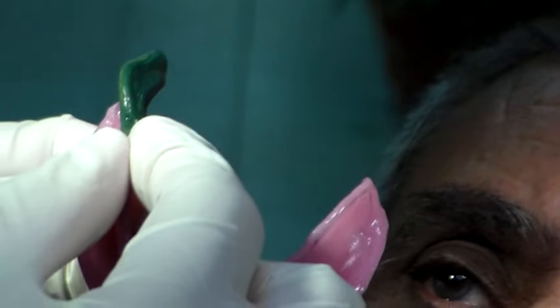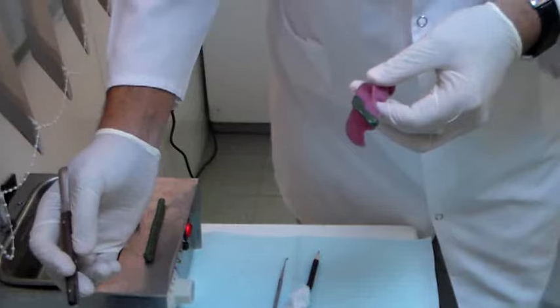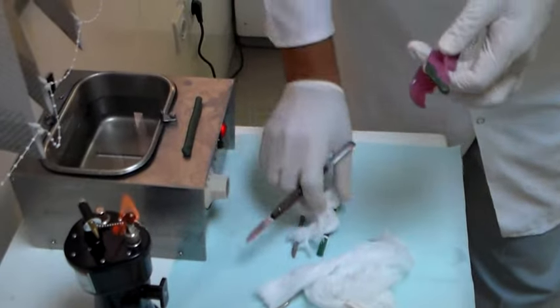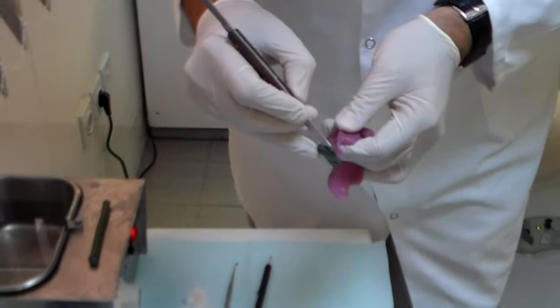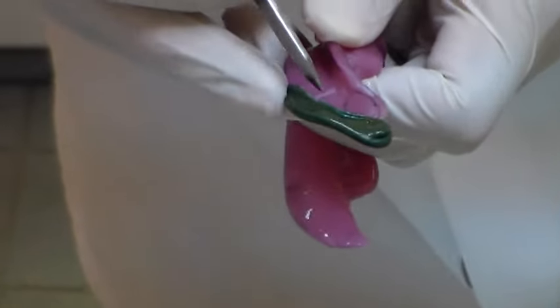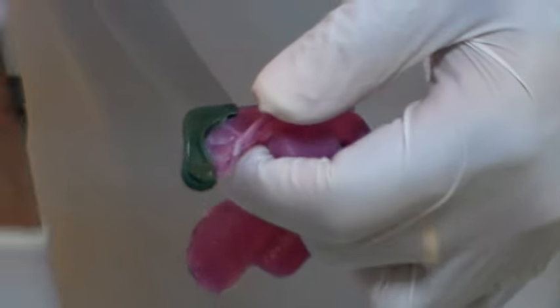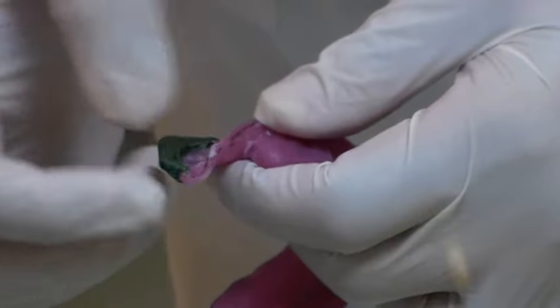Now you can see the reverse S very clearly, and the correct width of the vestibule as well. I want to remove the excess and add some material in the retromolar pad area before I go to the other side. To remove the excess, heat up your instrument — make sure it's clean — heat just the tip a little bit, and simply draw it across to take off the material. If the instrument is too hot it will melt too much and won't come off cleanly.